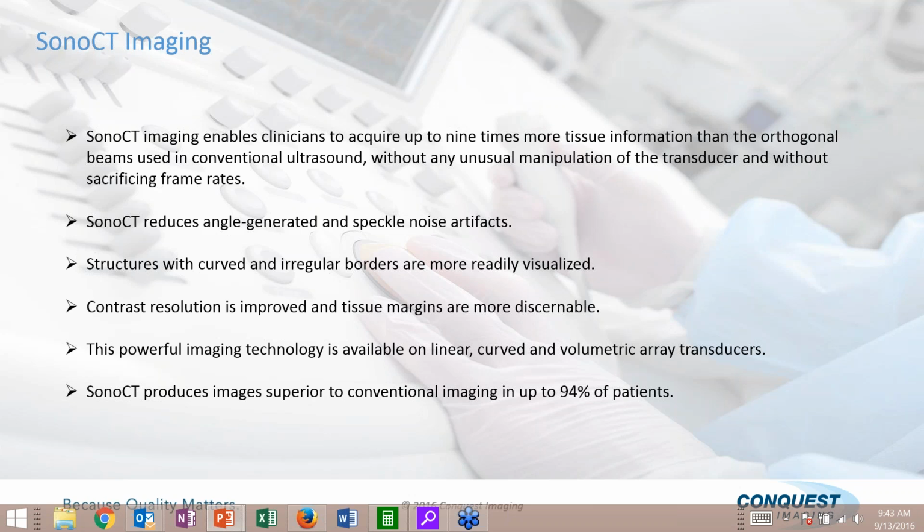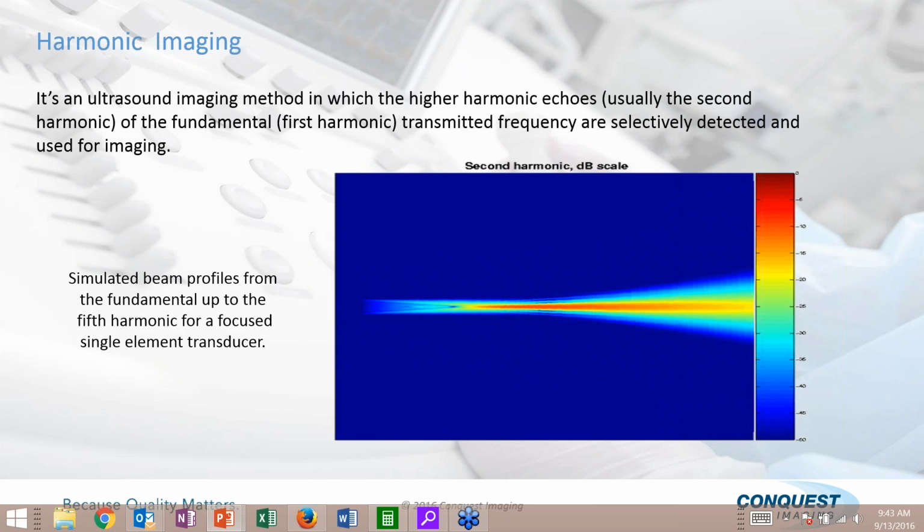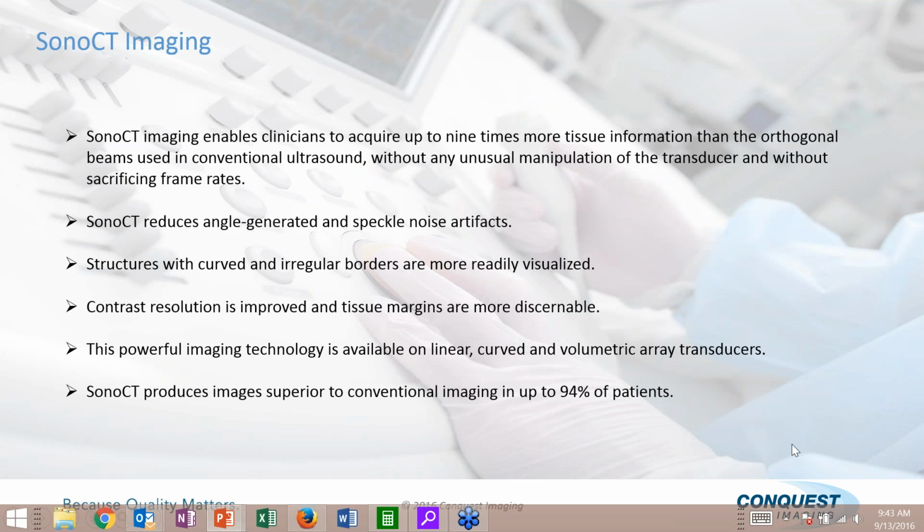So if you look at this image here, oh, let me back up. I don't have an image, I apologize. But what it does is it reduces angle-generated speckle noise artifacts. It improves our contrast resolution. It also makes the image very smooth. And it has been shown to improve diagnostic outcomes in the vast majority of patients. So it's a really cool technology.